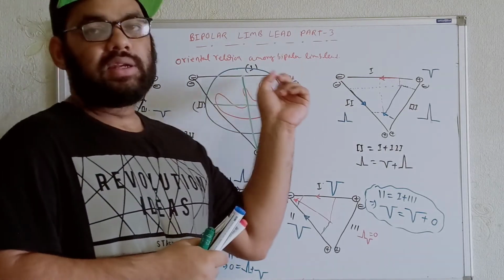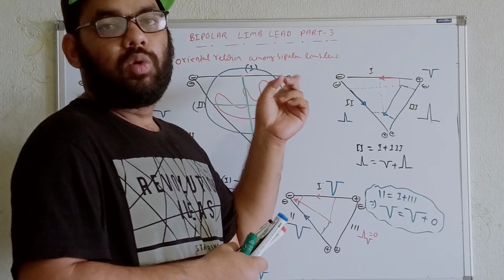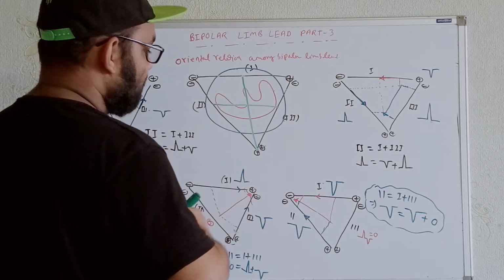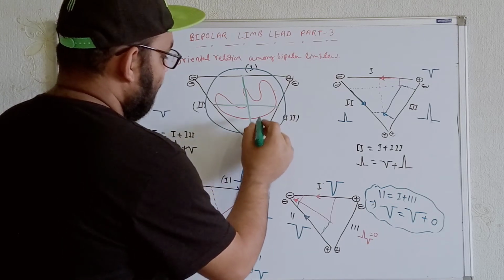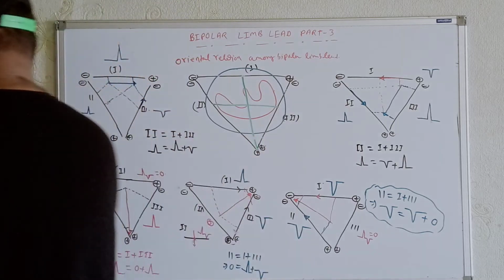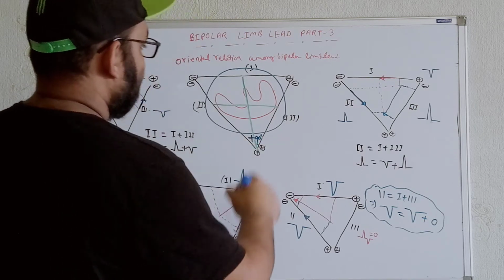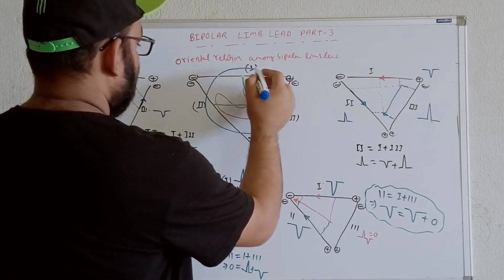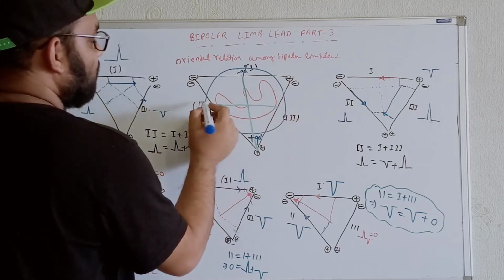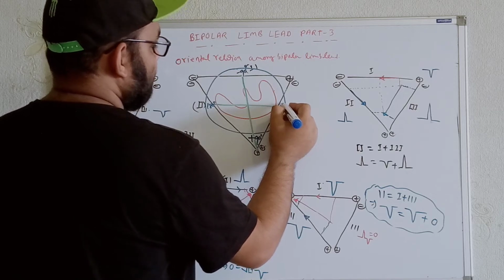Now in terms of the ECG, whenever we get positive deflections, that means towards the positive side of the leads, we have to consider positive values. So whenever it is coming in these directions, the positive values will be over here. That's why I'll consider this value plus 90 degrees. In the opposite direction, we'll get minus 90 degrees. And I have to consider this as a straight line, so this will be 180 degrees over here, and here we have to consider 0 degrees.